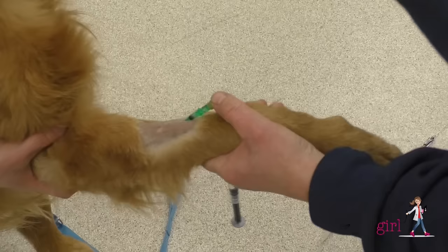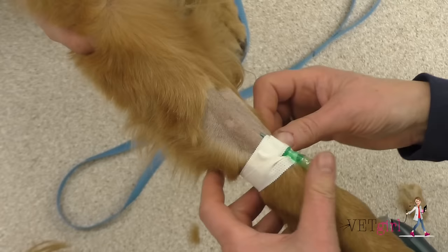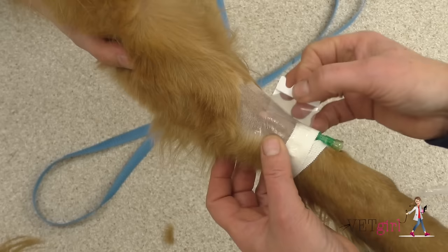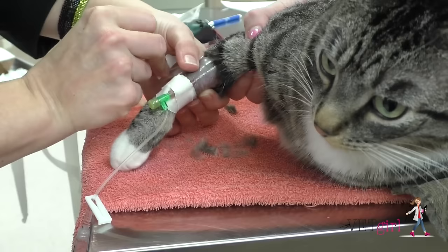Once the catheter is in place, it should be secured with white tape, securing the tape around the catheter hub and T-port. A small piece of tegaderm can be used to place over the insertion site. This will protect the site and allow for daily visualization as needed. Make sure not to tape the catheter too tight or toe swelling can occur. The flushed T-port can now be secured onto the catheter with an injection port as needed. Additional vet wrap can be applied around the catheter site as needed also.